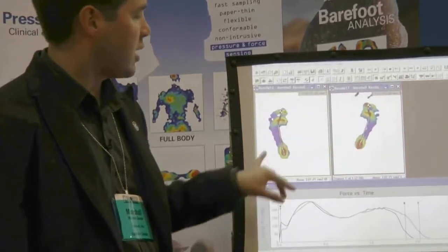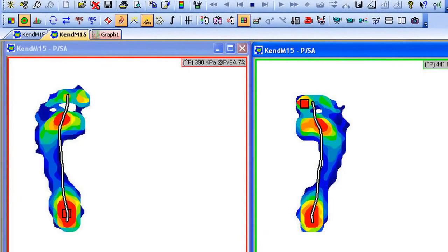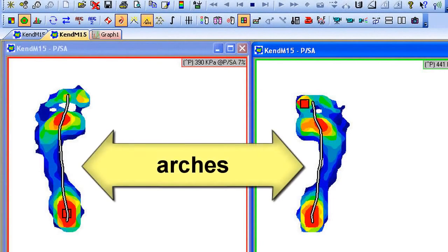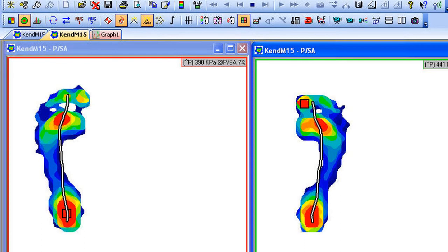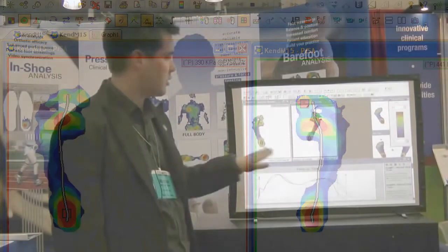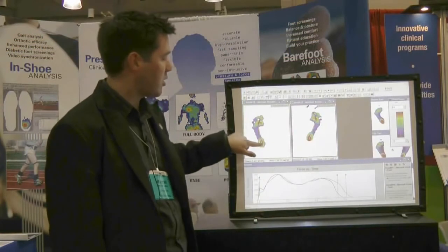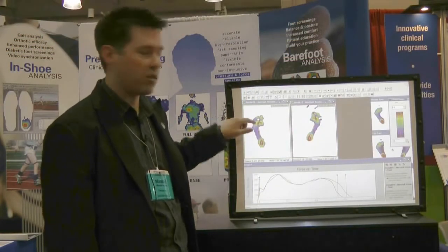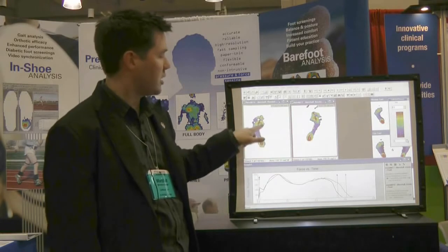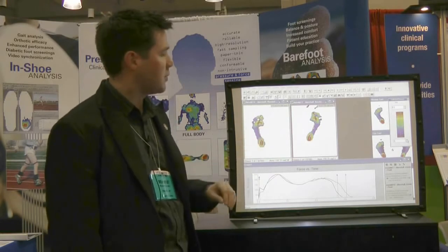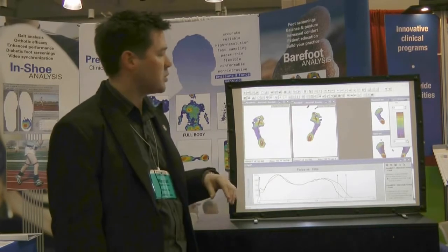We're able to look right away and see if there's any differences between the color scales of the left and the right foot, and in this area here we're able to see if there is an arch — for someone who may have a flat foot we'd probably see a little bit of fill in this area as well. This line on both feet represents the center of force, and as the person is walking from heel to toe this center of force will progress over top of the foot. It will also give us an idea as to how the forces move — if the person supinates, for instance, you might see this center of force come more on the lateral side of the foot. Someone with a very flat foot will see the center of force travel pretty much directly from the heel to the first metatarsal head, so it will give you an idea of any differences there might be between the left and the right foot.